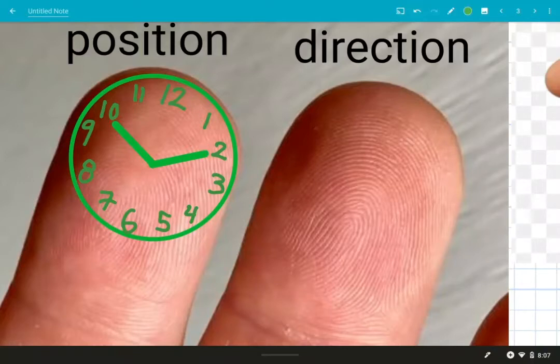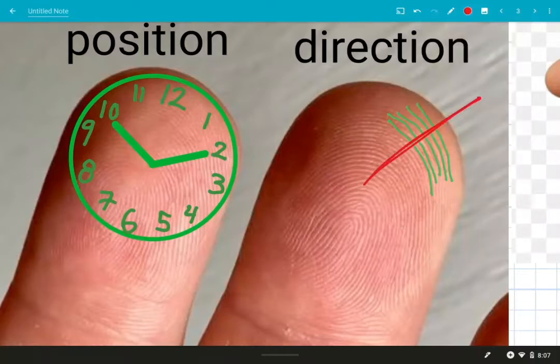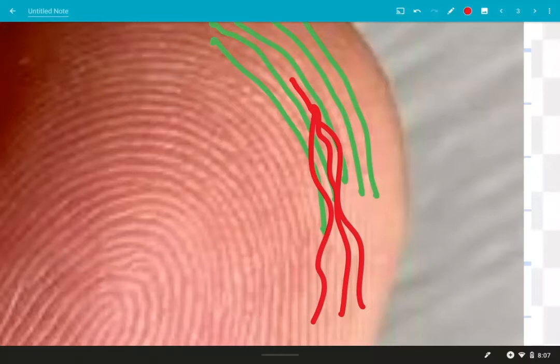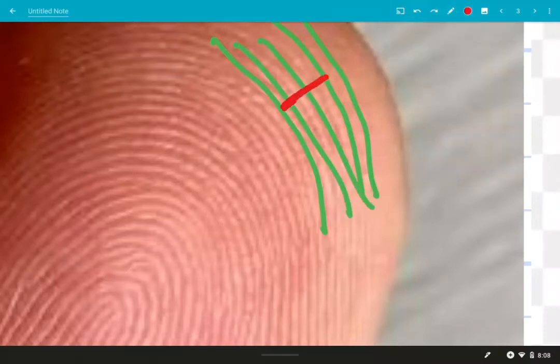When you are positioning your lancet, make sure you are going to push that blade in so the blade is running across the ridges of the fingerprint. So if this is the direction of the fingerprint, you want to make sure that the blade is oriented like this, not like this. If you have a cut like this, it's just going to run down those ridges and create a big mess. And it also is not going to give you that drop that you want. Instead, you're just going to have sort of a shallow puddle, and it's going to be really hard to get a sample that does not include skin cells. Instead, you want your cut to look more like this, because then you will build up that nice big drop.